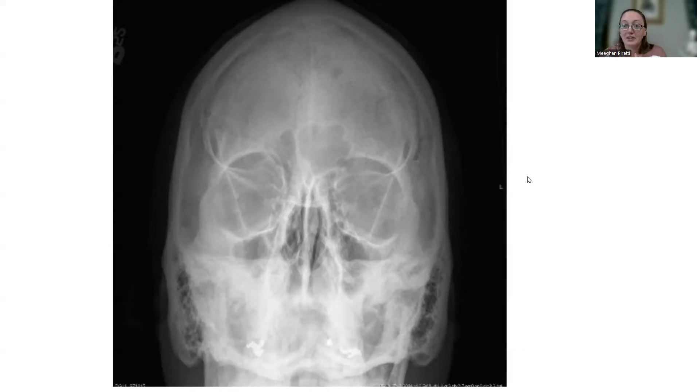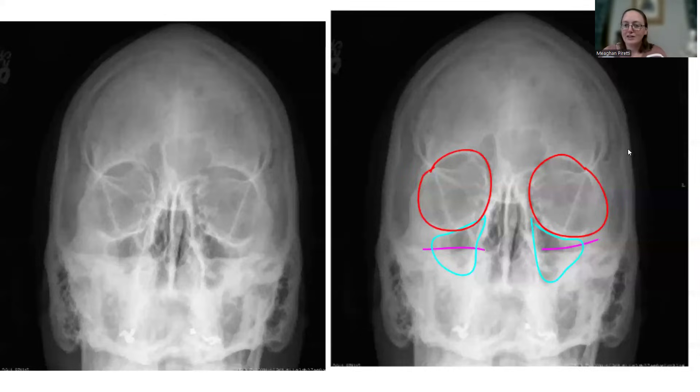Here's a really bad X-ray — we'll say this was supposed to be a parietoacanthial Waters view. It's super obvious, which makes this practice a little bit easier. Here's my arts and crafts: here are your orbits, here are your maxillary sinuses. These ridges are in the middle of those maxillary sinuses — we need a significant kick up to lower that down.